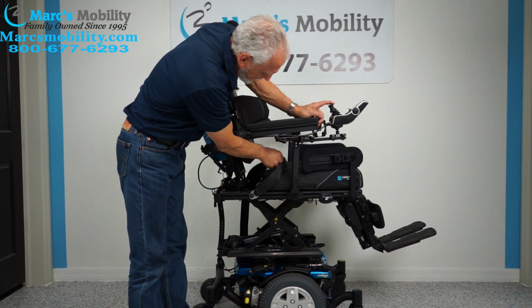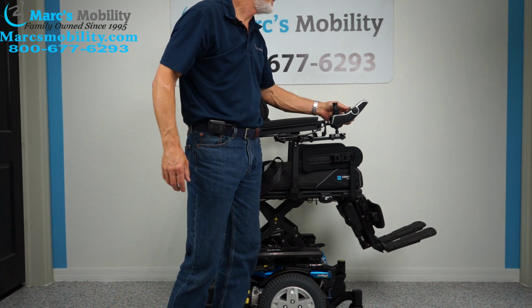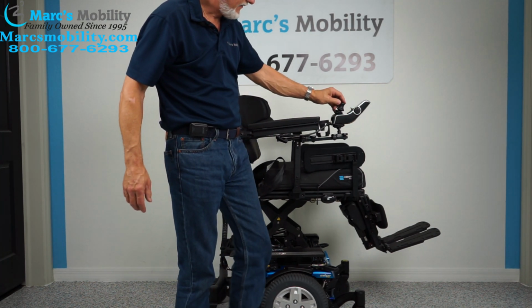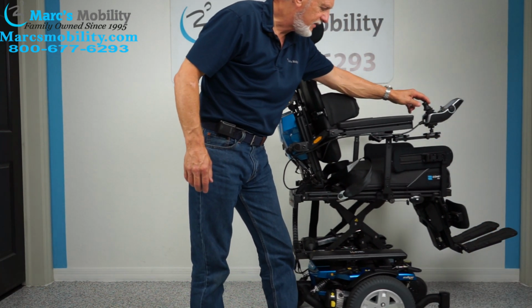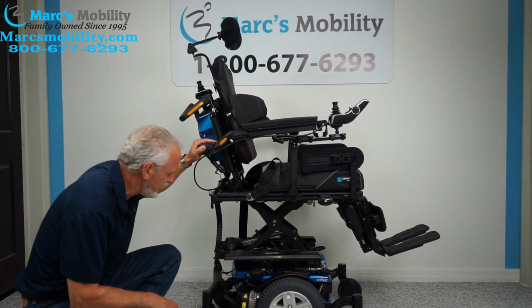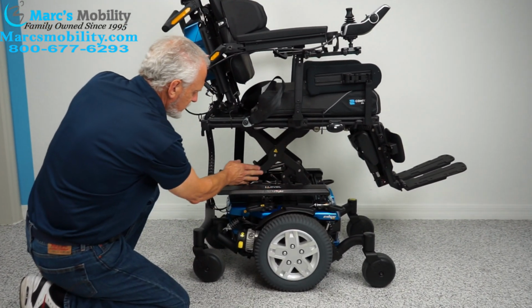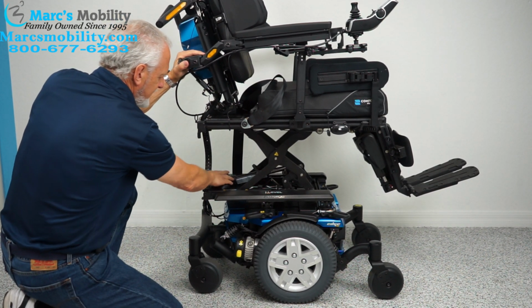There's a safety belt also here. So when the seat's elevated, just to give you an idea, you can still drive the chair at a decent speed. I can't show you in here, but it does move really good with the seat elevated. So while we have the seat elevated, let's look at the base. We can see the structure of the seat lift, the armature. We can see the actuator right here for the seat lift.